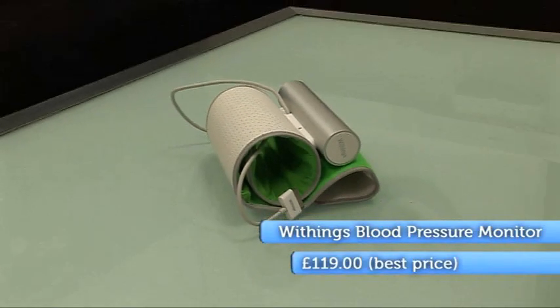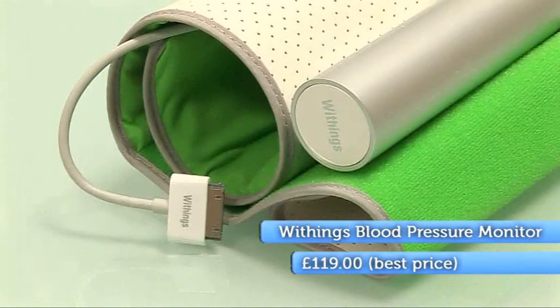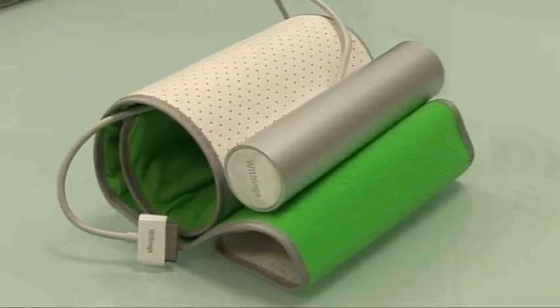There's a new one that works with all manner of iDevices — iPhones, iPods and iPads. It's called the Withings Blood Pressure Monitor.